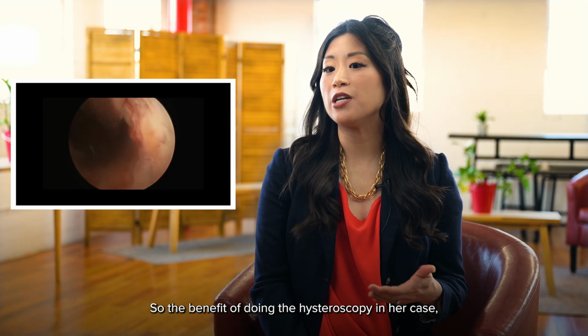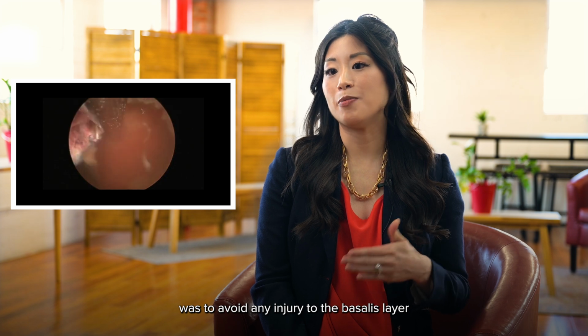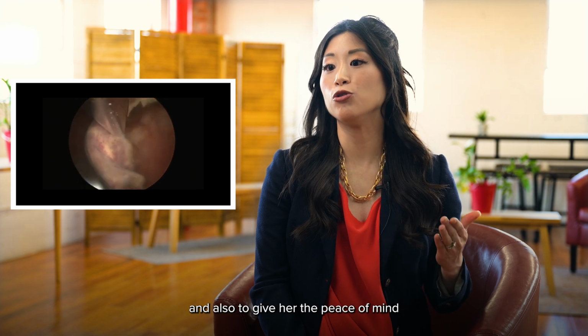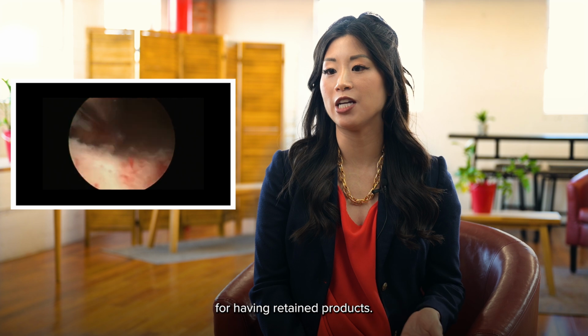So the benefit of doing the hysteroscopy in her case was to avoid any injury to the Basalis layer that would result in more intrauterine adhesions, and also to give her the peace of mind that all of the tissue had been removed and there wouldn't be the chance for having retained products.